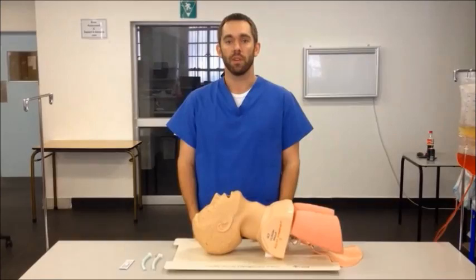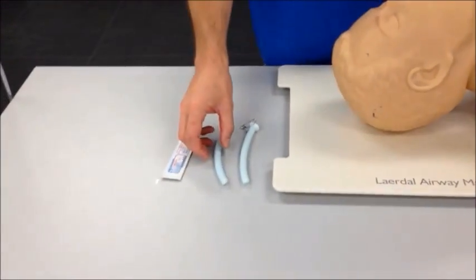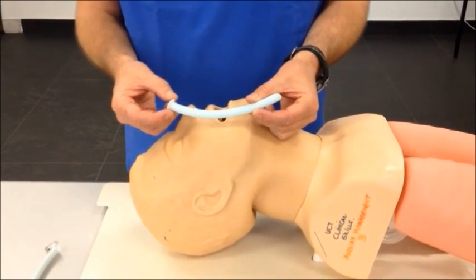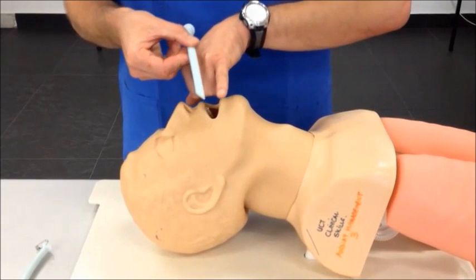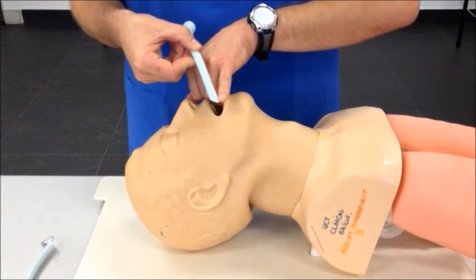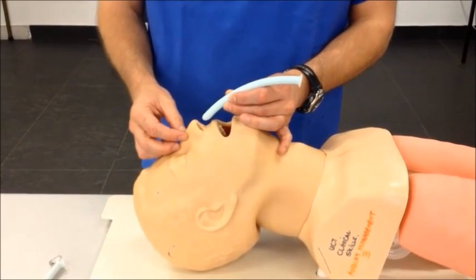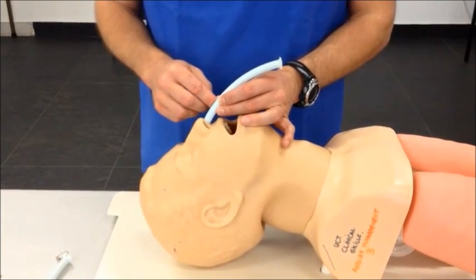The first step in insertion of a nasopharyngeal airway is to select the correct size. There are two sizes to consider: the diameter of the tube and the length of the nasopharyngeal airway. A good rule to select the diameter is that it should be approximately the same thickness as the little finger of the person — more correctly, the width of the little finger's fingernail. Alternatively, it should be the maximum diameter that allows insertion into the nose without causing sustained blanching of the skin around.